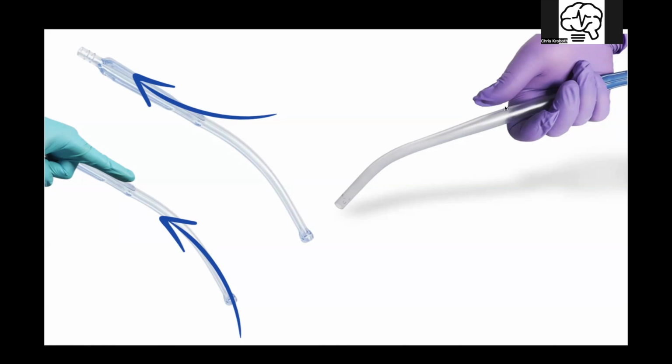or the cheek. Once you put your finger over that port, you close that circuit, and now the tip becomes the point to which the vacuum tries to neutralize, or the contents go up and in. So if your finger's not on, air comes in that port and goes out, the tip is not on suction. That little hole, you put your finger on there, now you create suction through there.